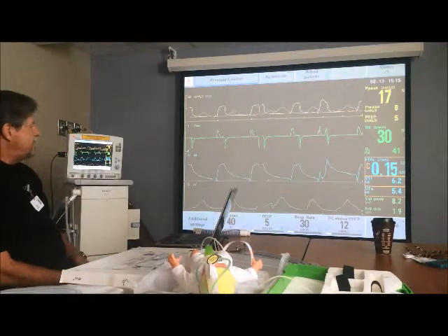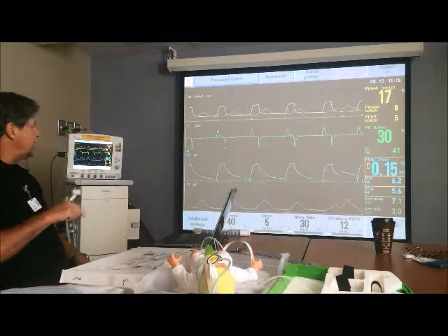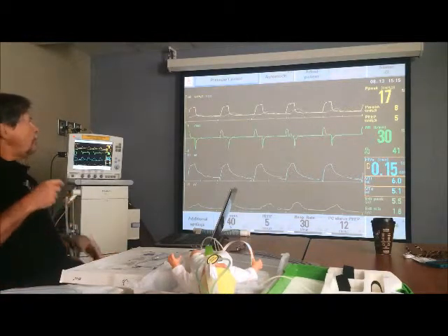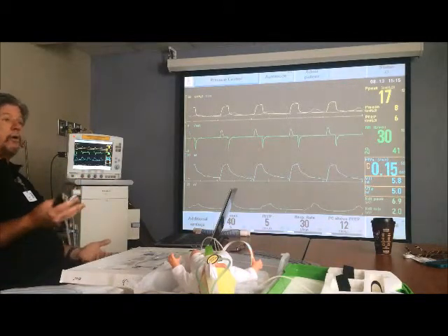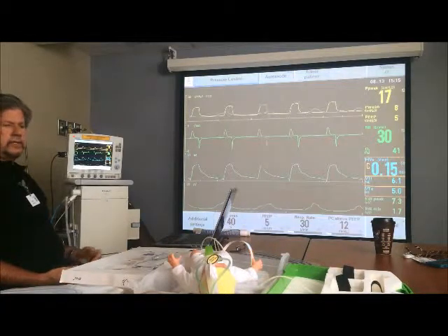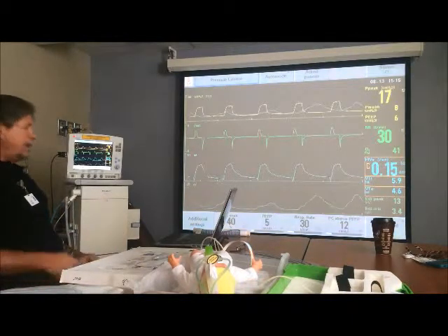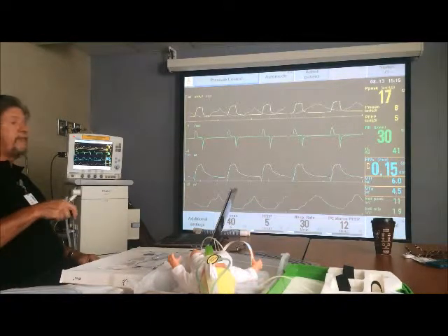We had it in a 13-year-old Guillain-Barré patient. Initially, when we put it on, the EDI was flat, which we would expect because he was paralyzed at that point. But a day later, we saw him triggering the ventilator. I went and asked, how is he triggering the ventilator? They said, well, he's triggering the ventilator. I said, is he triggering with his diaphragm? He said, well, that's how you trigger the ventilator. And I said, do you see an EDI there? It was totally flat.